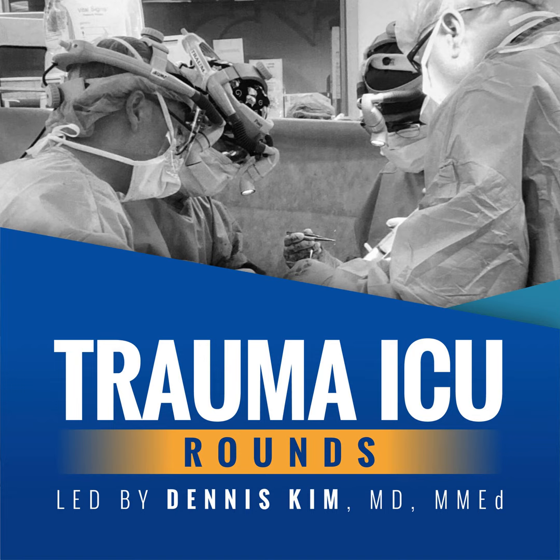Regarding the main disadvantages of volume ventilation, the big one here is that when lung compliance worsens, as say in the setting of evolving ARDS, peak pressures, and more importantly, alveolar distending pressures may rise, resulting in alveolar overdistension, baro, and volutrauma. And this is one of the major reasons that we monitor peak and plateau pressures in this specific patient population. Other disadvantages may relate to the inspiratory flow rate and pattern.